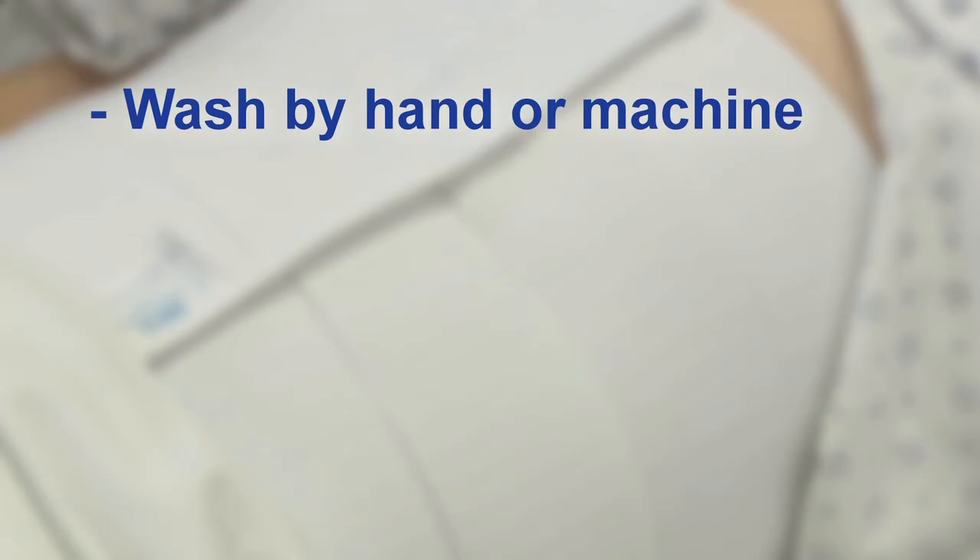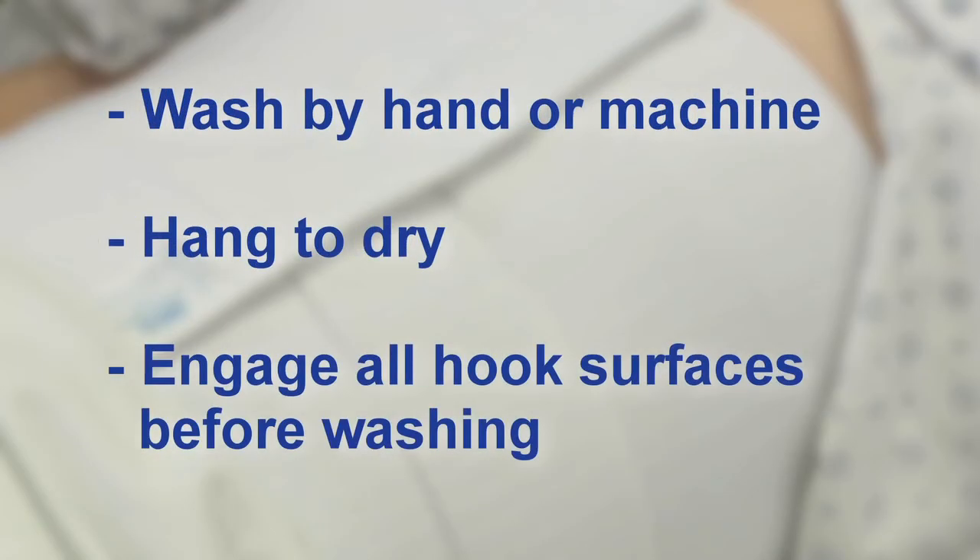The binder may be gently washed by hand or machine with a mild detergent and air-dried, but be sure to engage the hook surfaces completely before laundering.